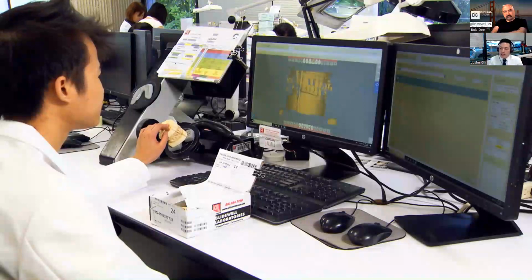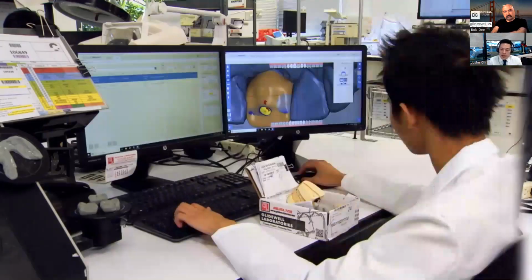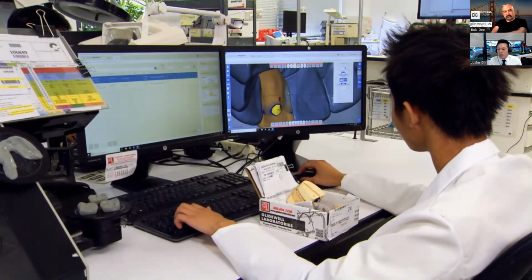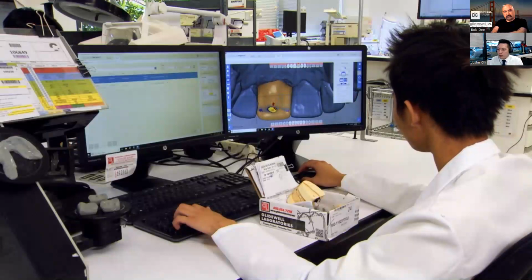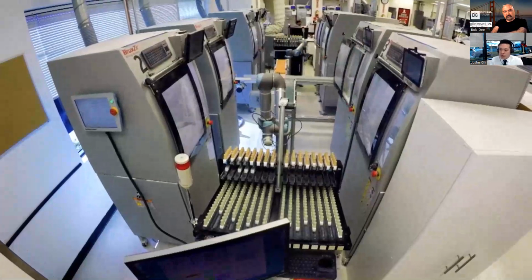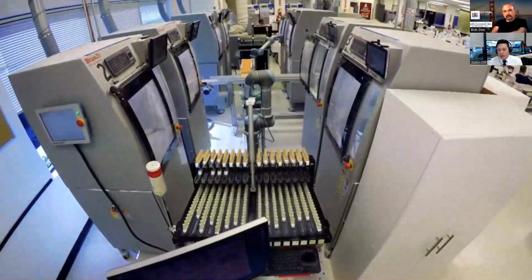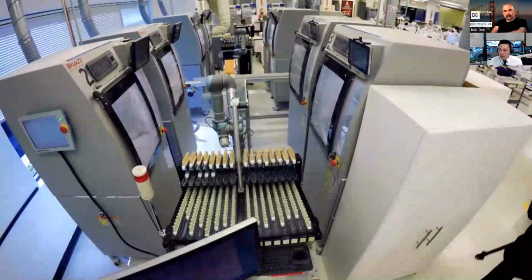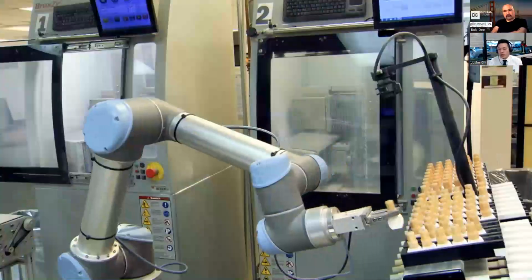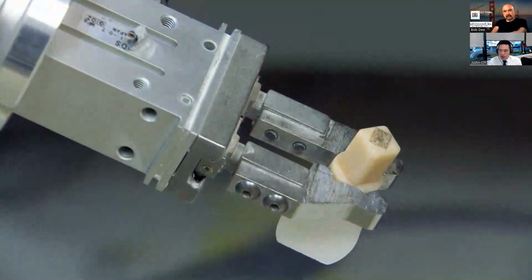If you are taking a conventional impression, it gets poured up, but then it gets immediately digitized. That's a benchtop scanner that sends the digital model to this CAD process, computer-aided design, where a technician is going to create the right contours, contacts, and establish all of those important parameters in form and function of that restoration. Once that design is completed, it gets transferred to the CAM, computer-aided manufacturing, which is essentially the milling process.